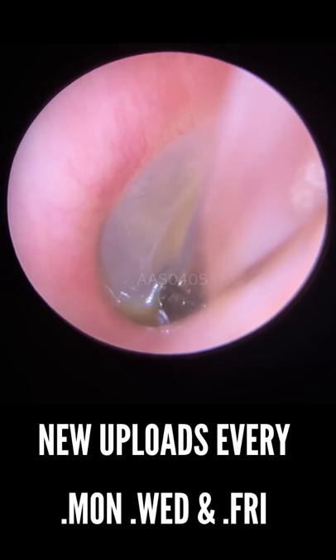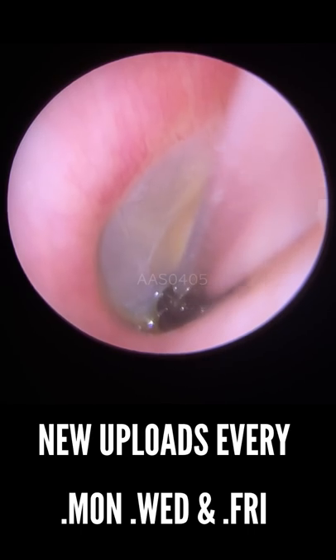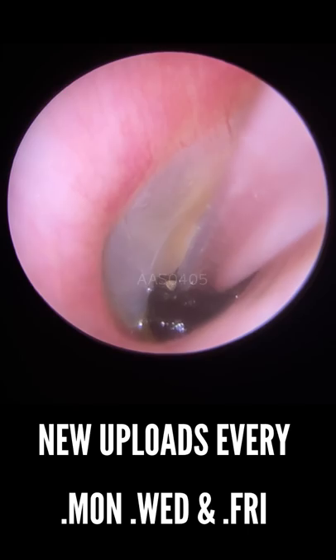So we've put a lot of olive oil in here because we're going to use the fine end just to lift this, as it's sitting just behind the recess, just in front of the eardrum. So we're going to lift very gently.